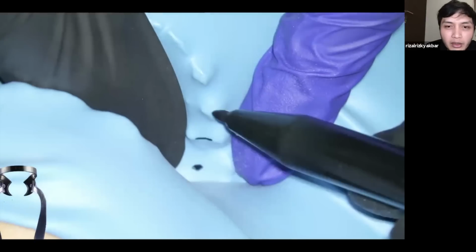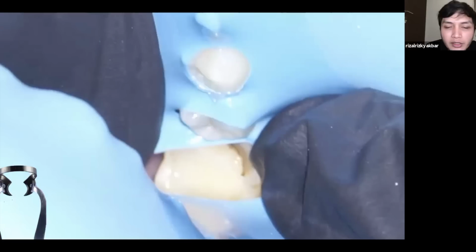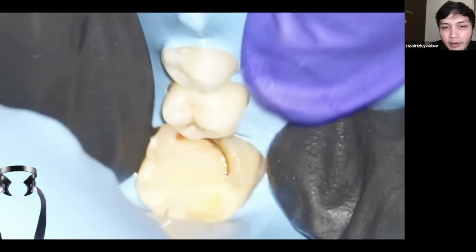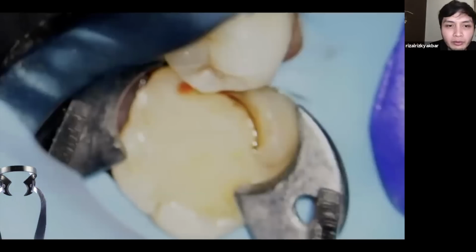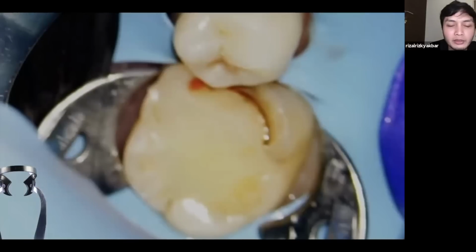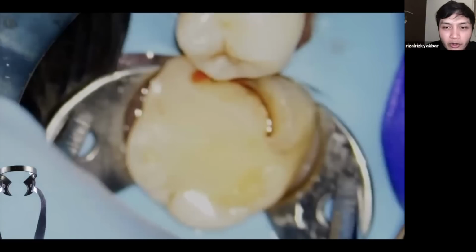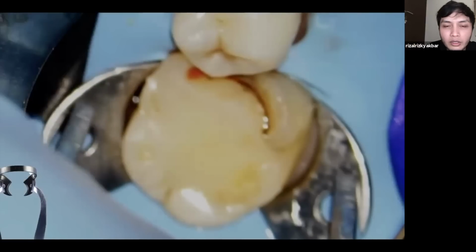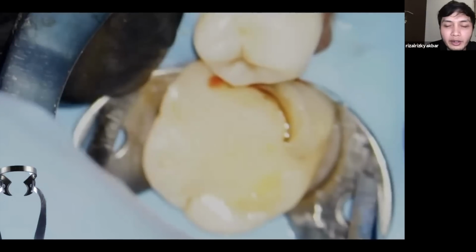This is an example of placing multiple isolation. The technique I like is I put the rubber first, followed with the clamp. You can even do a modification, like put the clamp first and then the rubber dam. It's up to you, but I found it really easier if you put the rubber first, followed with the clamp. And then you need to train your assistant to hold the rubber, and then you put the clamp as gently as possible.